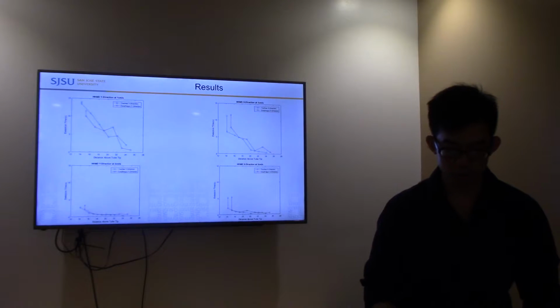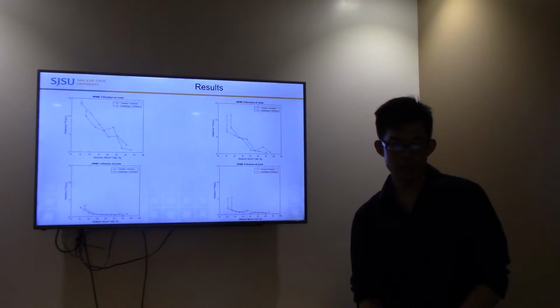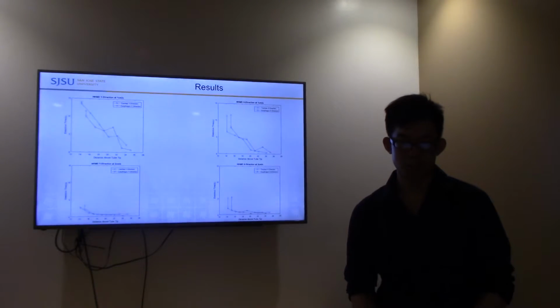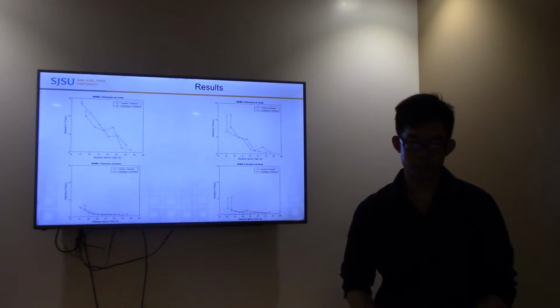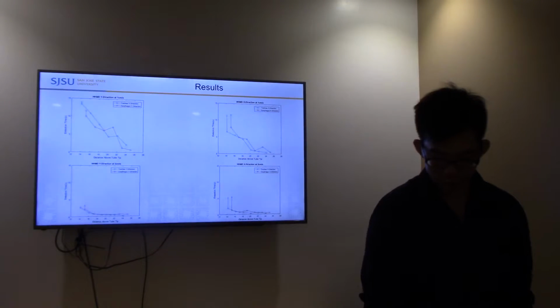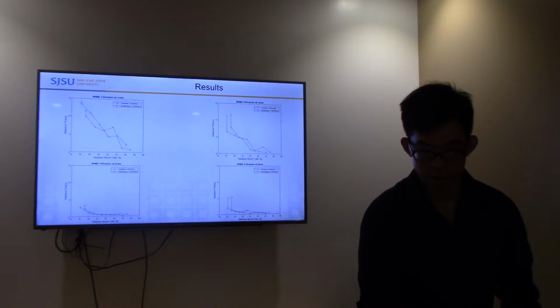And comparing it in a higher speed, it has a lower detection time in the x and y direction, but it seems like the esophagus is still higher. So from that, I can conclude that the y direction is more optimal.